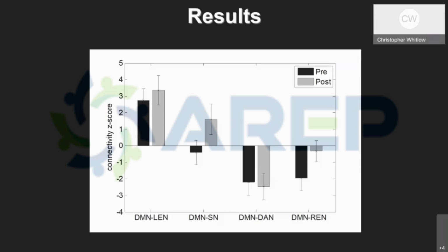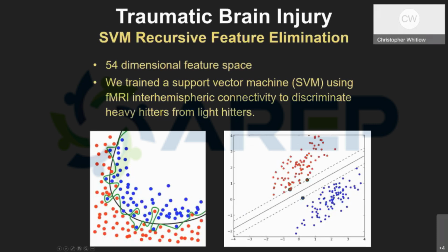But what's a little surprising is that these findings are similar to those seen in patients with concussion or mild TBI, although none of these patients had concussions. And we also have data showing that these network changes correlate with cognition measures of processing speed.